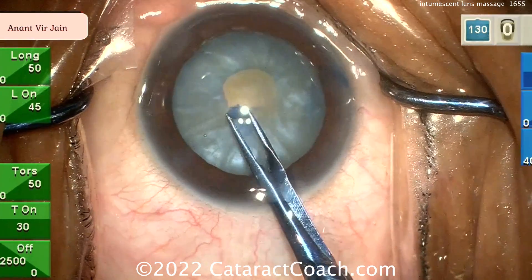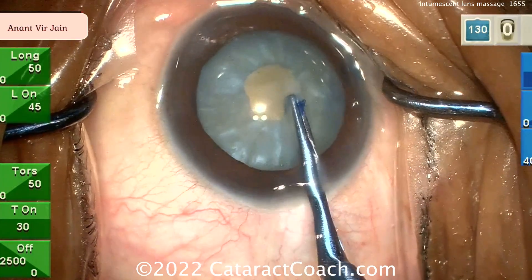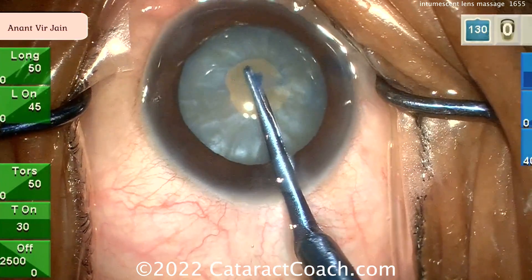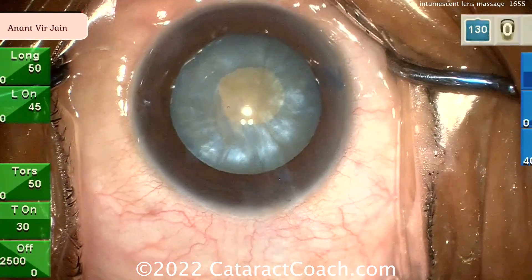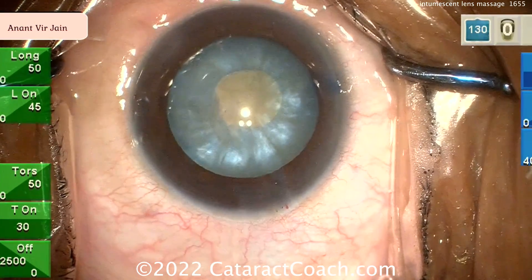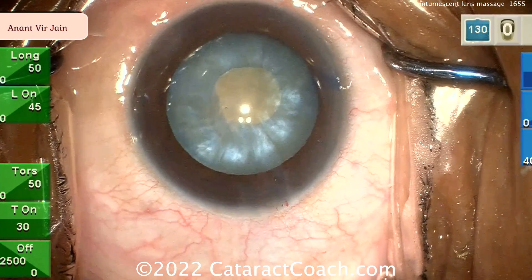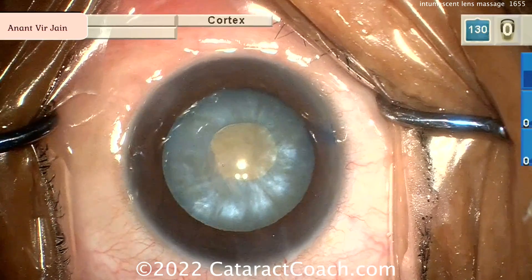Finish that, just pull — it doesn't have to be perfect, don't worry, just get it done. Now get the IA probe or the phaco probe, put it in there, and suck out a lot of that liquefied lens material. That'll really decompress the bag. Then you can do the second normal-size rexus and have a really nice result.